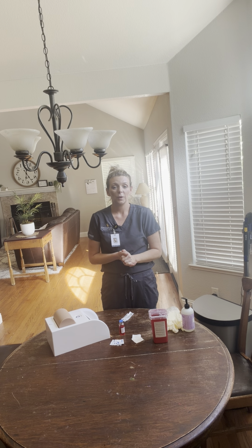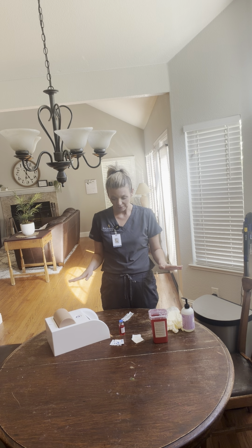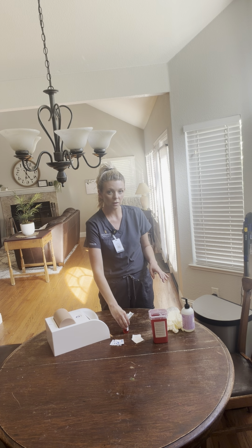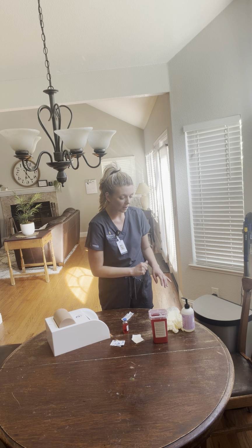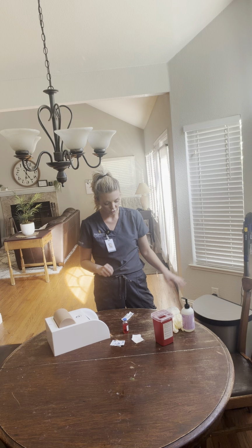Riley, and today I'm going to be doing an intramuscular injection skills video for Nightingale College. I have all my supplies here. I have my patient, my medication, which is a morphine sulfate today. I have my alcohol swabs, my gauze, gloves, hand sanitizer, my sharps container, my trash can.